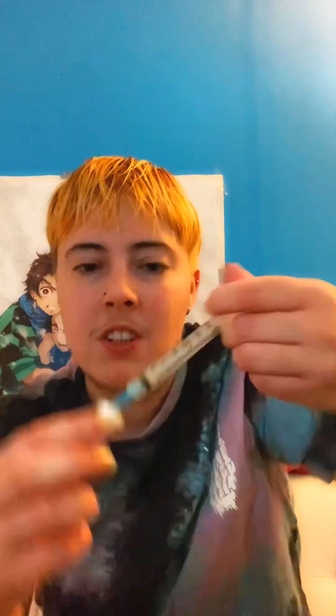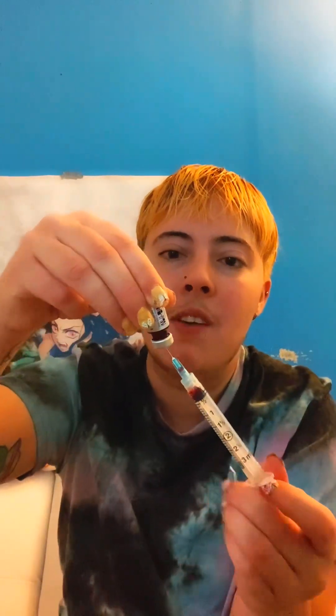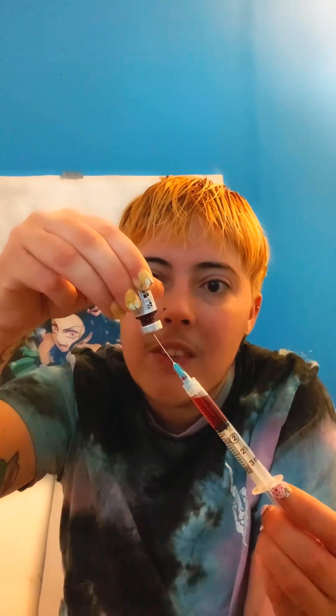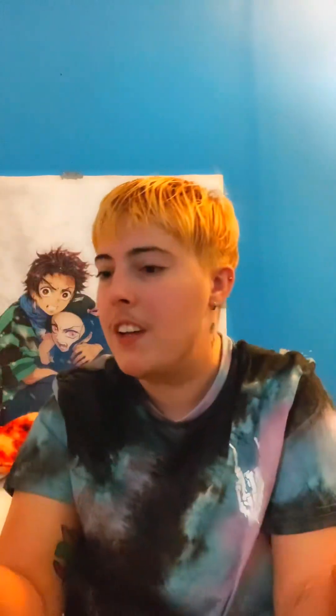Once it's dried, you pop the needle straight in — you don't want to dull it by going at an angle. Push it in, then pull the plunger back to draw the medication in. Get as much as you can — you don't want to leave much behind since that's your whole dose.